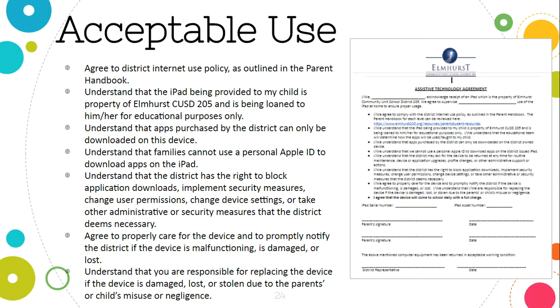Again, we're not going very many places these days, but if in the future you're able to drive to grandma's, this wouldn't be our media or how we're passing the time in the car.